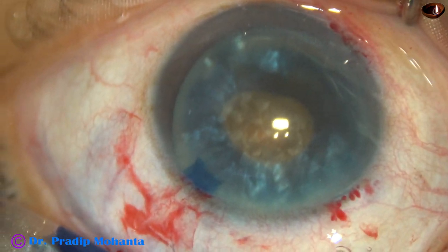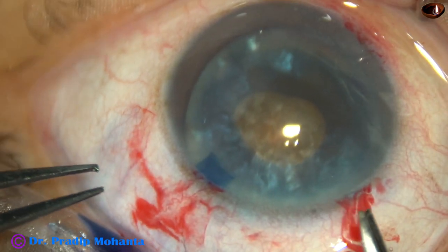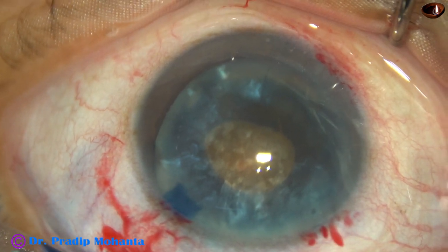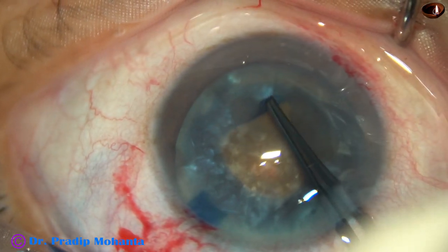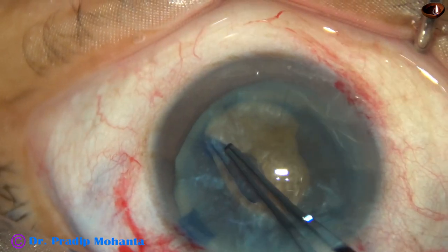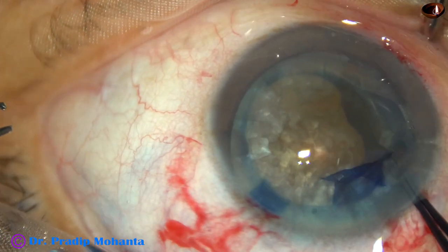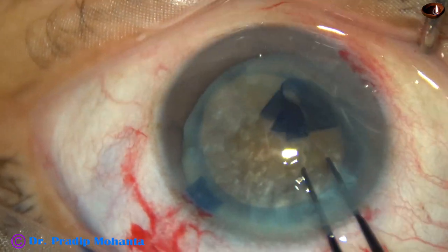Viscoelastic is injected, a Vannas scissor is taken, and a small tangential nick is made at the margin of the rhexis at around 8 o'clock. The Utrata forceps is taken again, the capsular tag is held, and with anticlockwise movement a large adequate-sized rhexis is made. The nucleus is big and hard, so a rhexis of about 5.75 mm is achieved.